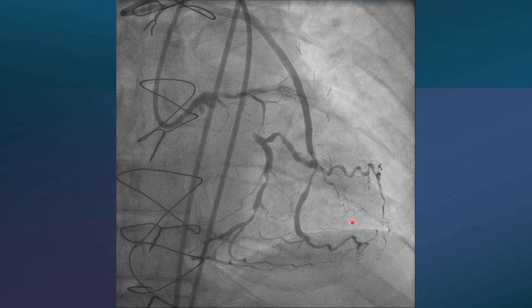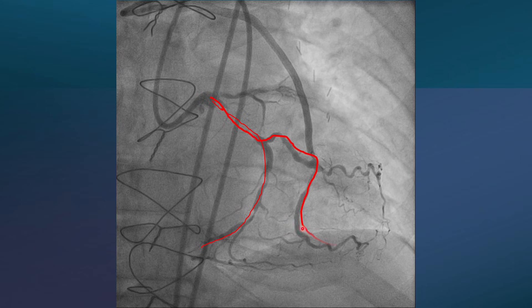The decision was not straightforward. We could approach through the SVG to open part of the vessel, but ischemia would remain in other segments. So we decided to open the circumflex itself. The plan required passing a wire through the CTO into the circumflex and also into the large OM, which has some tortuosity. There is a bifurcation from the left main to the LAD, a bifurcation from the circumflex to the OM, and a trifurcation — with the challenge being the angle to the proper OM. Our aim was to open the CTO and treat this bifurcation.